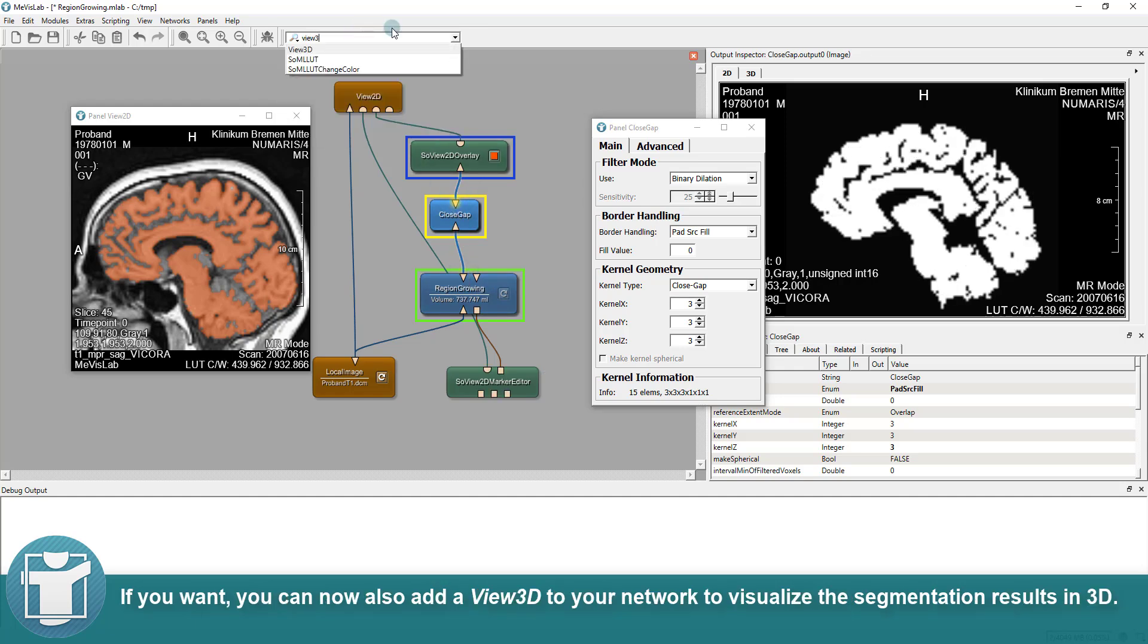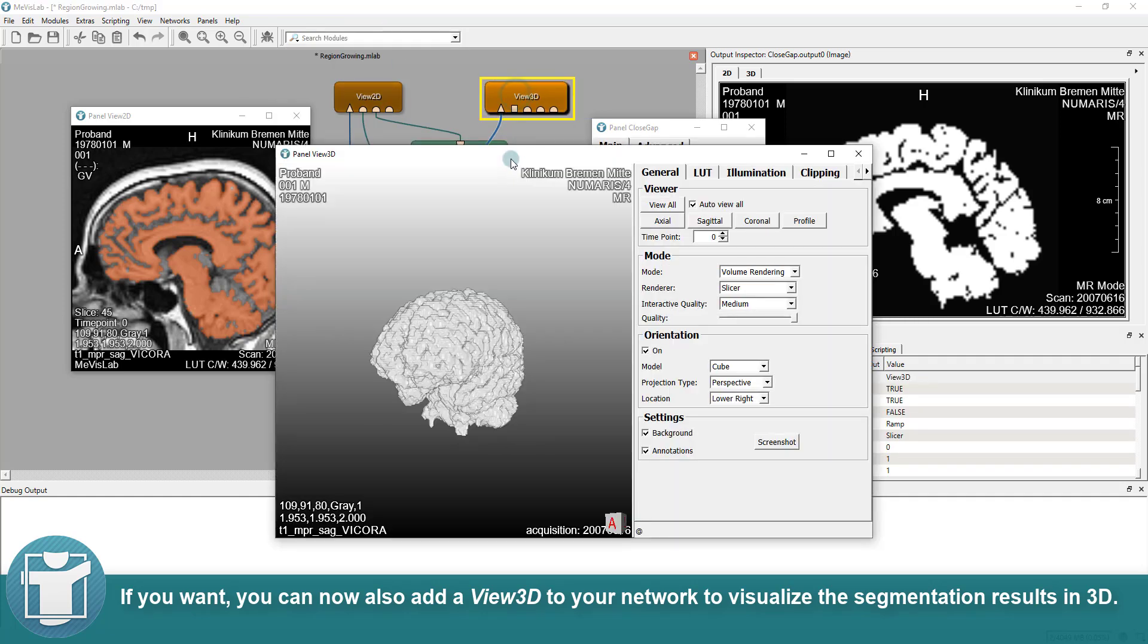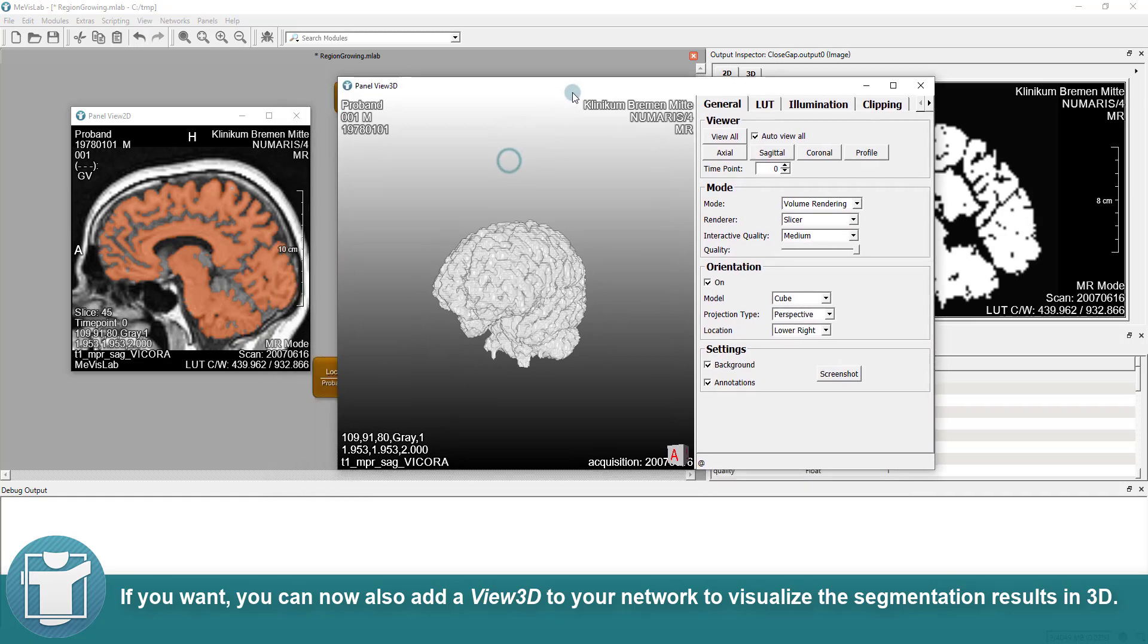If you want, you can now also add a View3D to your network to visualize the segmentation results in 3D.